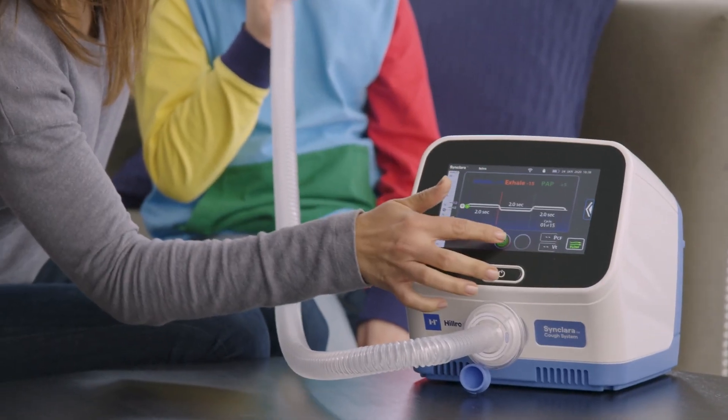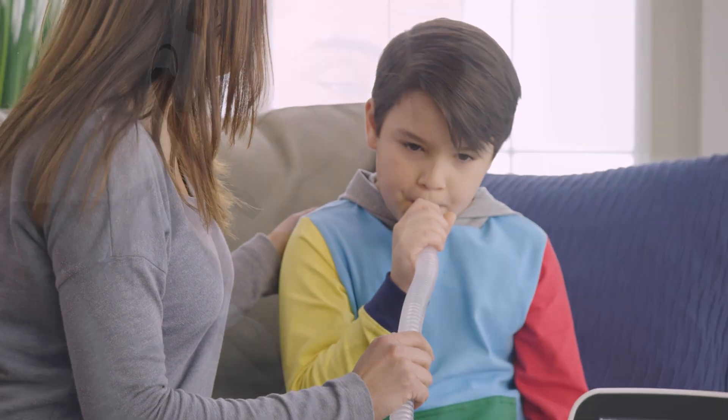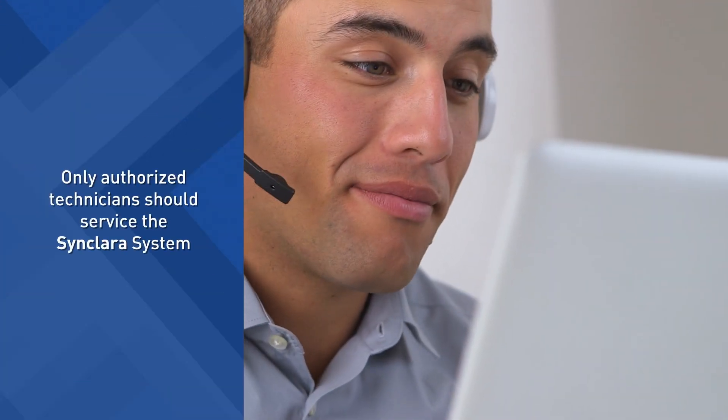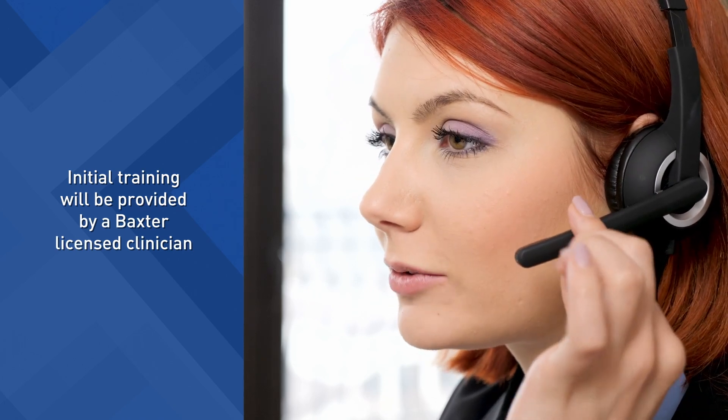For complete instructions on the Sinclair Cough System, please refer to the user manual. Only authorized technicians should service the Sinclair Cough System. Initial training on safe and effective use will be provided by a qualified trainer.